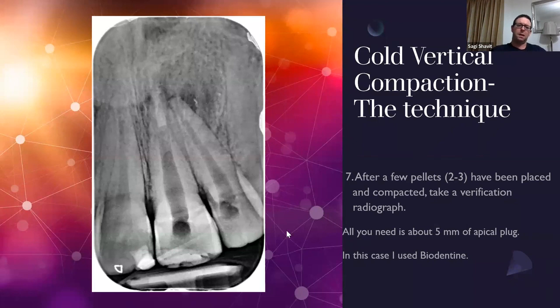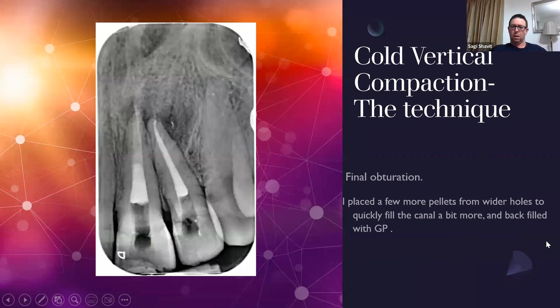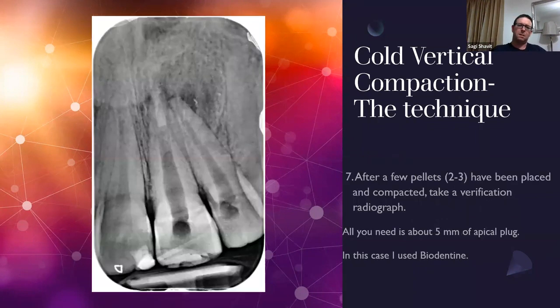Okay. And in this case, I used biodentine, okay? I decided to use biodentine. Now, this is the final obturation, okay? I've filled both of the teeth. I filled a bit more with biodentine. The only reason that I did that is because biodentine, you get a bucket of it. So I just didn't want to throw it away. I just used it, okay? But all you need is, if we go back, that's roughly how much you need to create a good apical seal in an open apex case, okay?